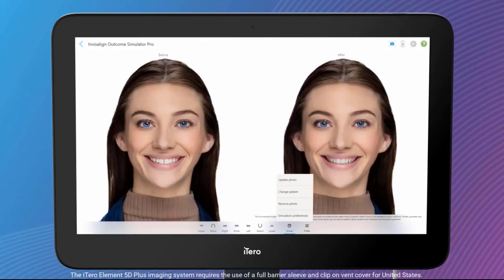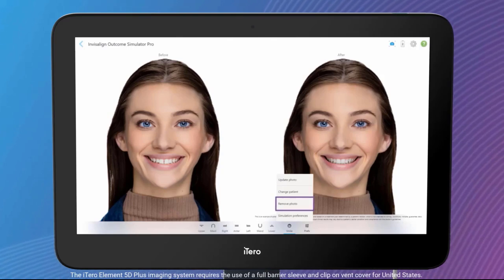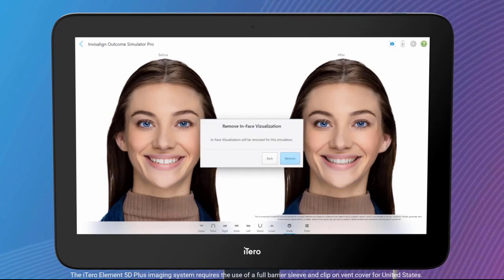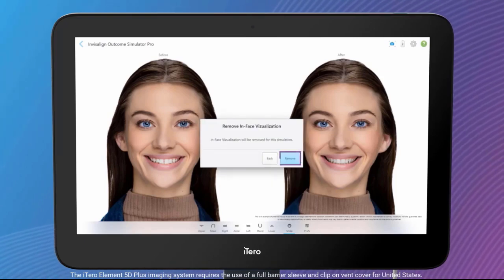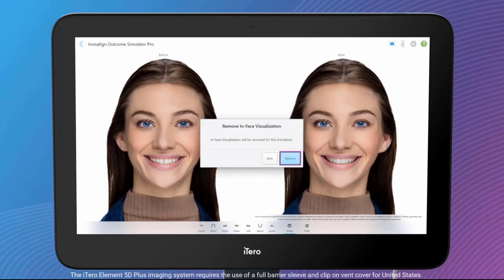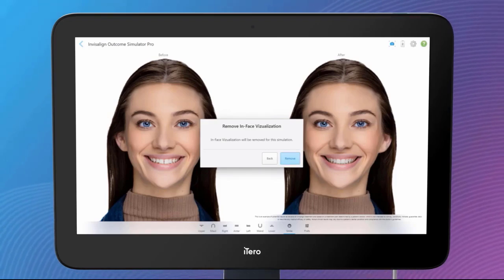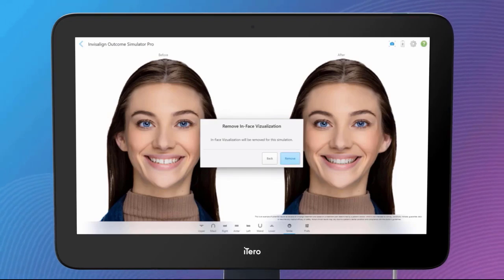The patient photo can be removed to only show the 3D model if desired. Tap on Remove Photo from the Preferences menu and confirm the removal by tapping the Remove button. Adding another photo to the simulation can always be done at a later time.